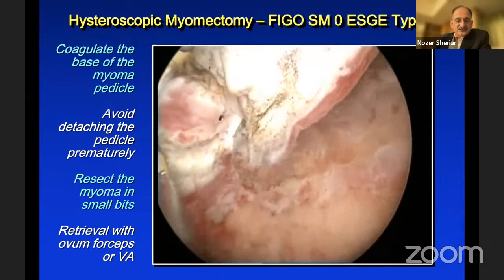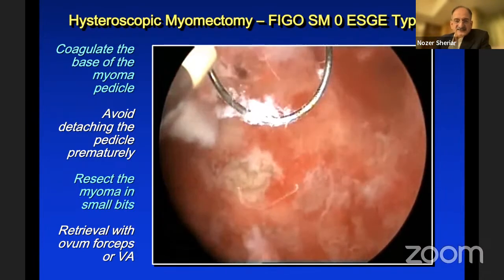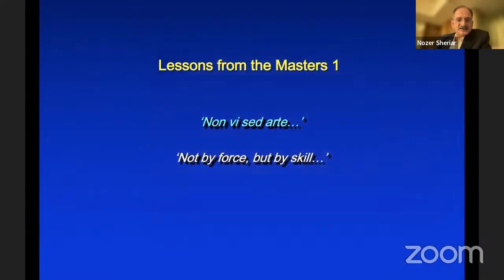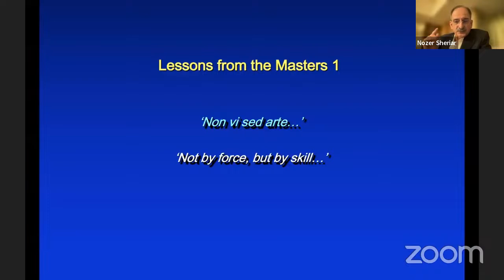After going through everything, the pressure bags and the endomat, I must confess that most of these cases I do with pure gravity. I'm happy to see a few blood vessels. The biggest mistake a hysteroscopist makes is to try and go for a completely white, bloodless uterine cavity. The moment you do that, your pressure gradient is towards the vessels and you could have a problem, mainly with a myoma where you would be opening up large vessels. So be smart, be clever, learn to master different ways of doing it.